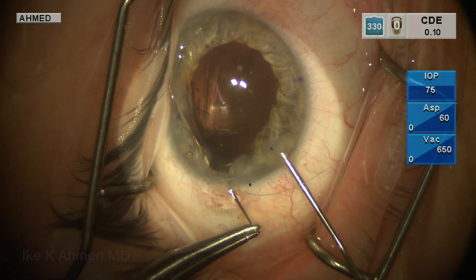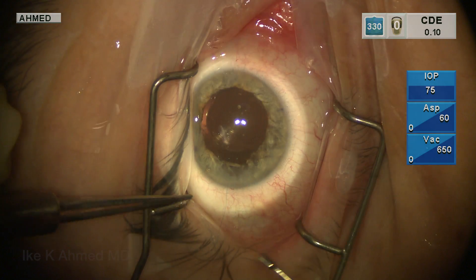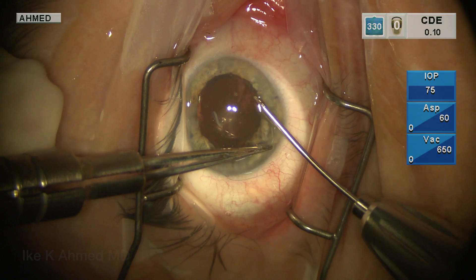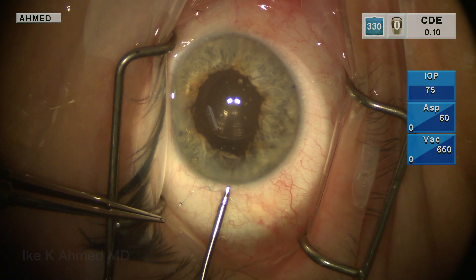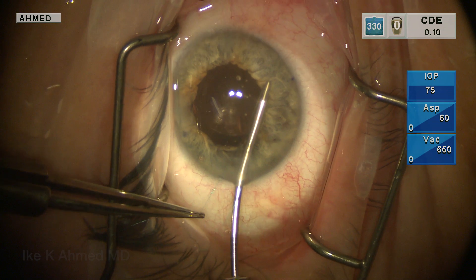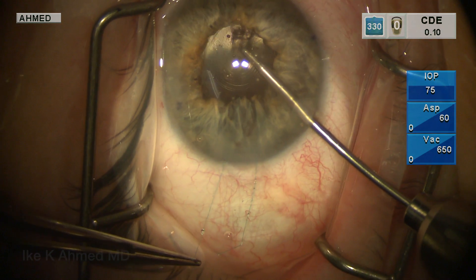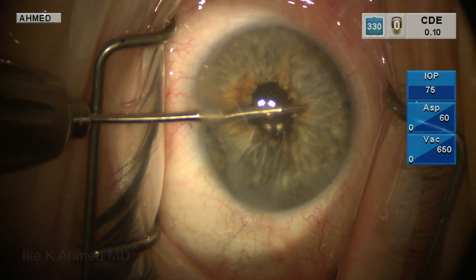This allows us to have the sutures out through the main incision. As you see, we've come nasally all the way around temporally using a double-armed suture. We'll then tie the suture with a pair of micro-tyers. The micro-tyer here is being used to essentially pass the suture knot into the eye. This is a modified mechanical technique — as you see here, we're basically drawing the knot into the eye to create a pupil of adequate size and shape.